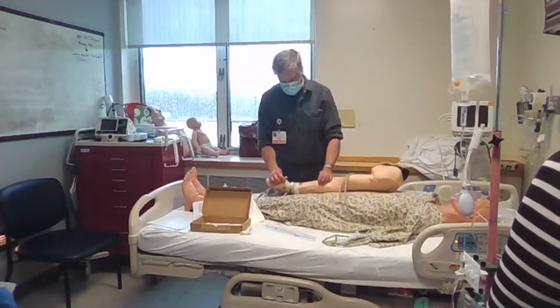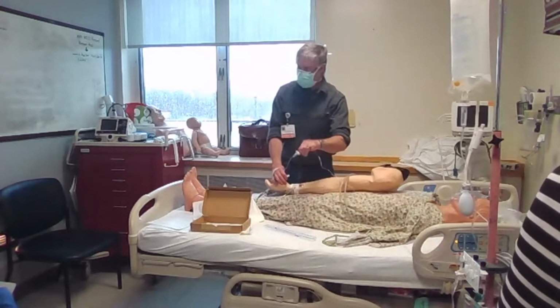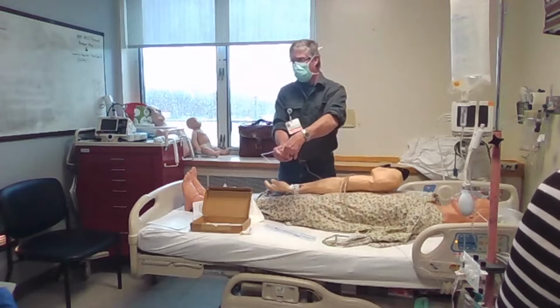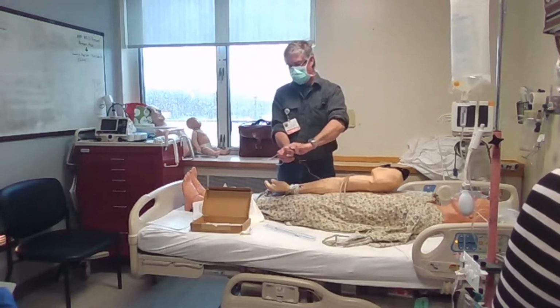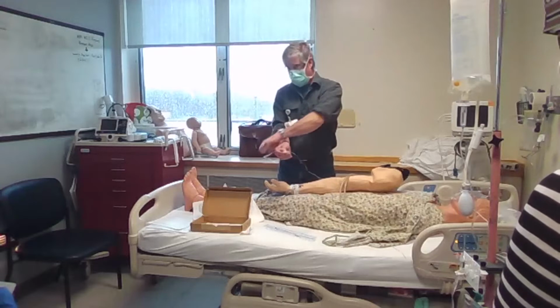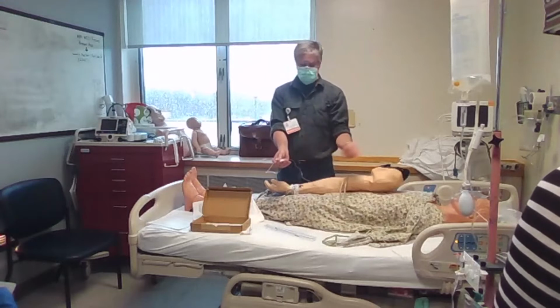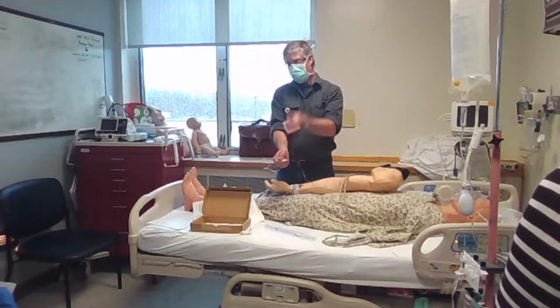So flush it or draw back on it. Two easy things. Draw back on it from here. That's always the best place. In this case, you're going to want to draw from the patient side, so you're going to close from the pressure side, you could call it. You take the tip off. You put your syringe on because blood flow is going to come back if it's a functioning A-line. You open it and it's going to come back at the pressure that's being delivered to the patient. So a lot of times you just do that and it's going to fill your syringe up.